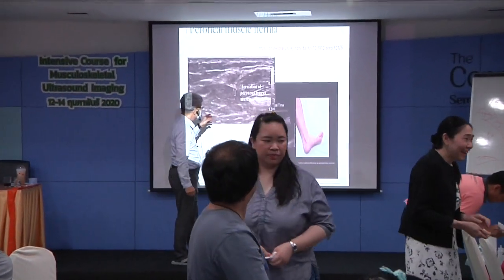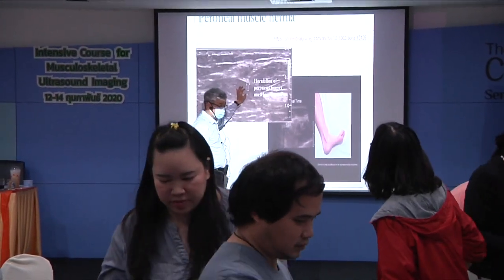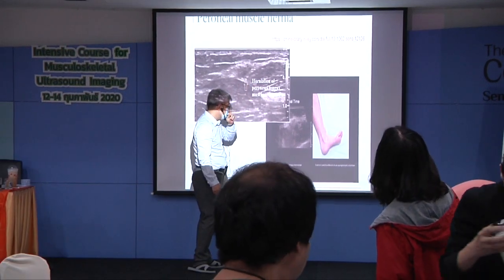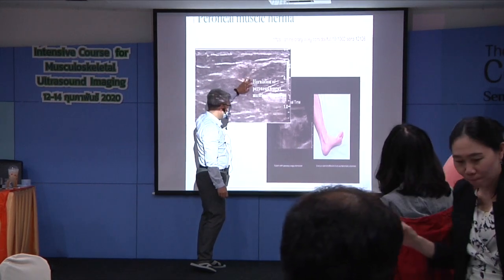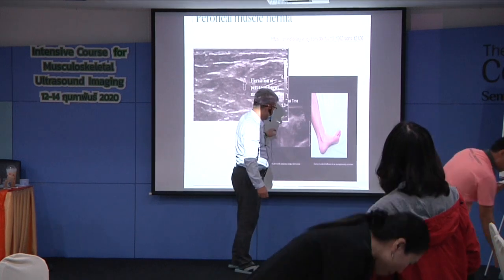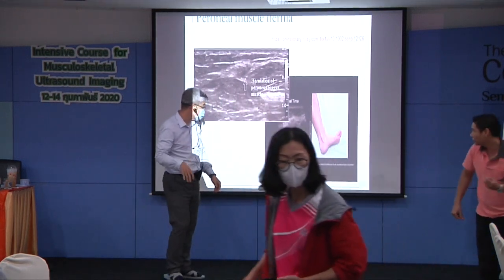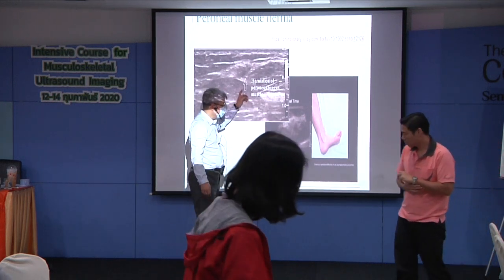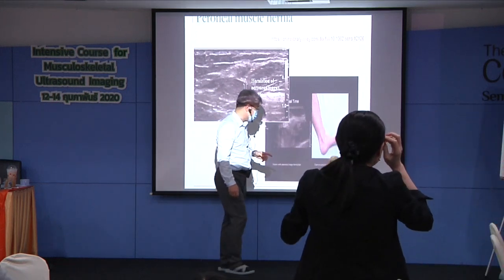If you observe there is a gap produced between the skin and the longus during the dorsiflexion, or dorsiflexion and eversion, you may suspect herniation of the peroneus longus.